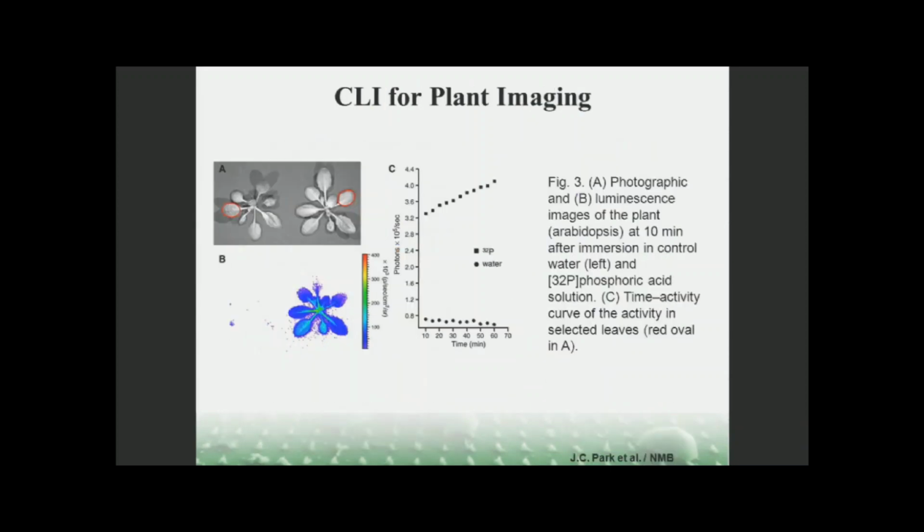And for the applications, once this term Cerenkov luminescence imaging was given, people tried to find different applications for this technology. We can talk about many different applications, but today I will just briefly mention a few and then talk about the endoscope.